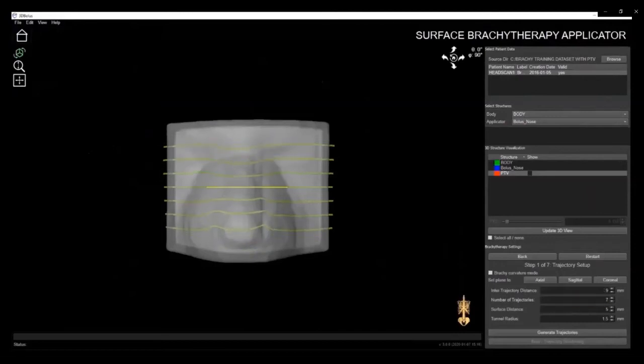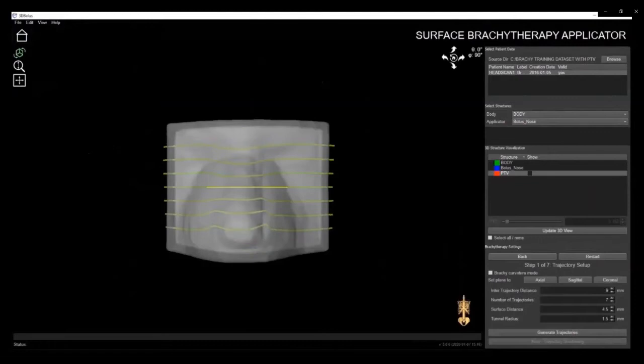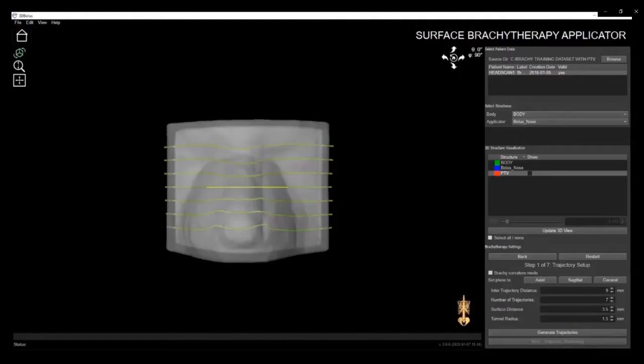In the latest version of our software, we have added many new features, which we'll go through now. One of the new features is located in the 3D Structure Visualization window. You can select a structure you'd like to see, in this case, the PTV, and click on Update 3D View.